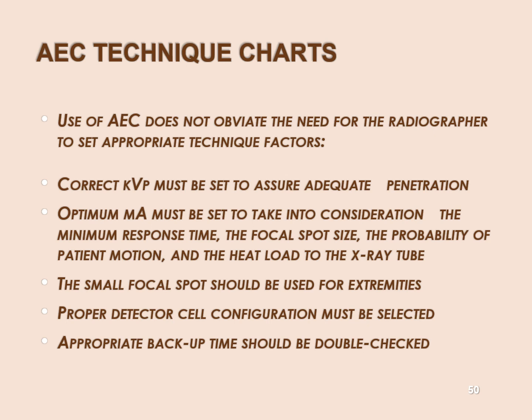So, you need to set the correct kV for adequate penetration still. No change in mA compensates for inadequate penetration. In fact, that's a great way to overdose your patient. High mA, high backup time, but the kVp is inadequate to penetrate. Like if you're using 50 for a lumbar spine AP, right? And you set a backup time for 600 mAs, what's the final exposure technique? 50 kV at 600 mAs.